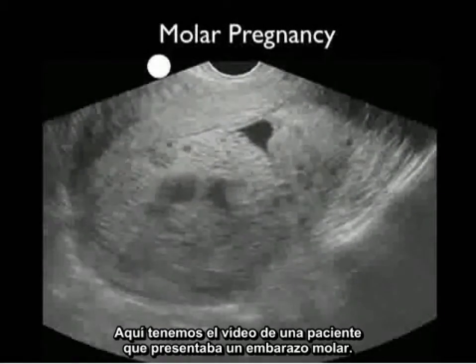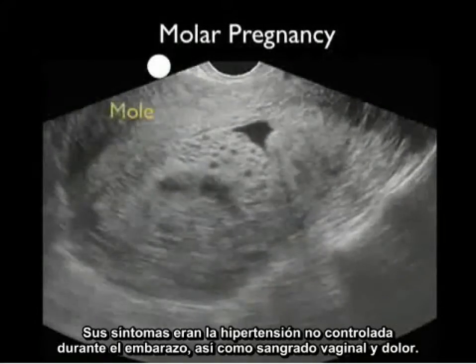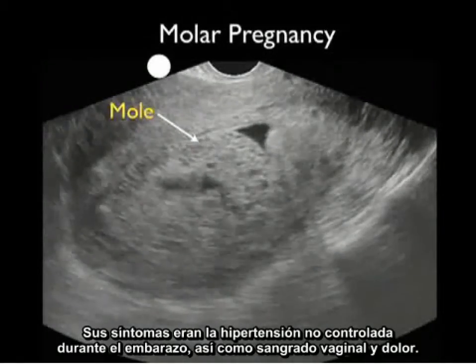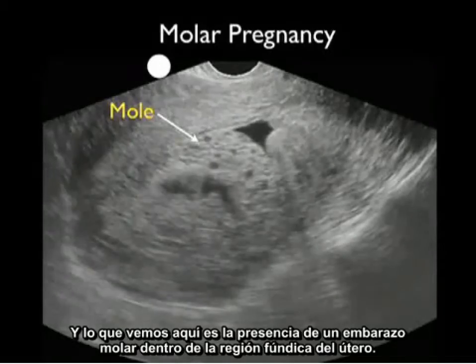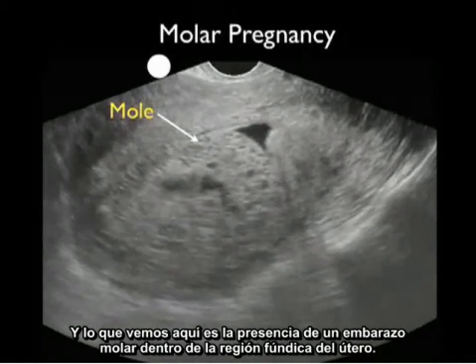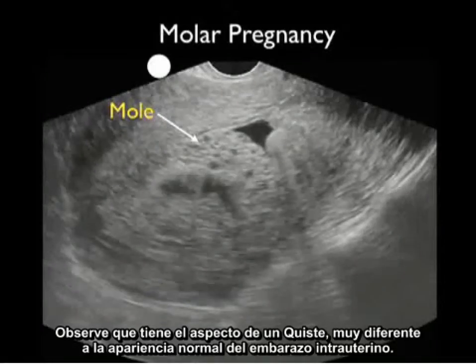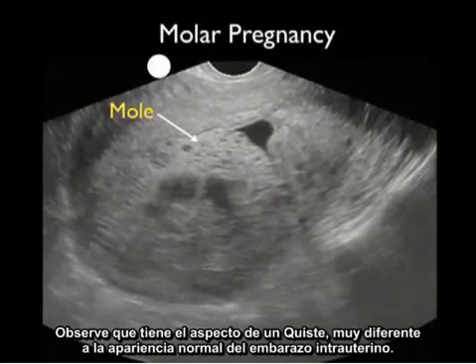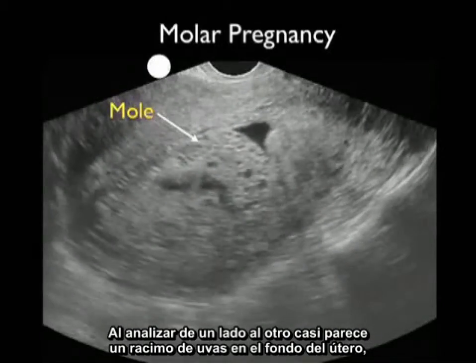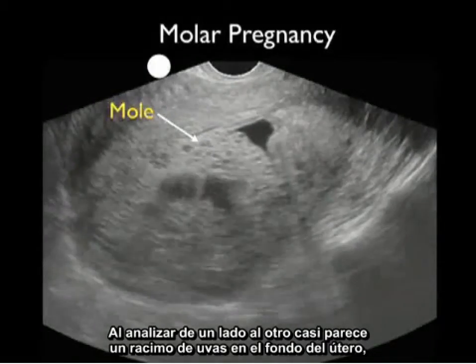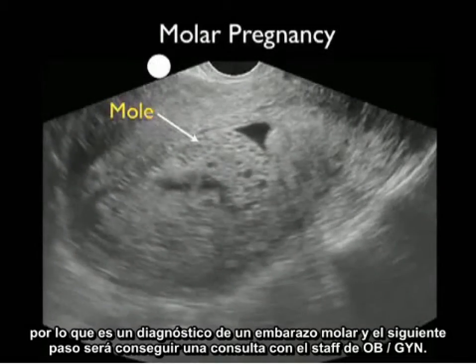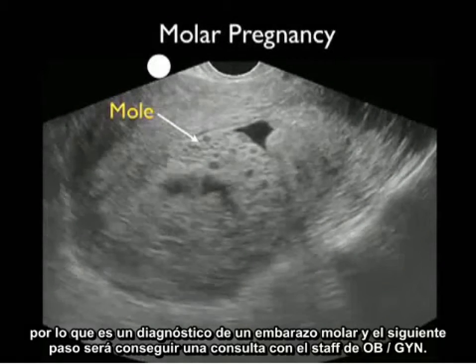Here's video from a patient who presented with a molar pregnancy. Her presenting symptoms were uncontrolled hypertension during the pregnancy, as well as vaginal bleeding and pain. What we see is the presence of a molar pregnancy within the fundal region of the uterus — notice it has a cyst-like appearance, very different from the normal appearance of an intrauterine pregnancy. As we scan back and forth, it almost looks like a bunch of grapes within the fundus of the uterus. My next move was to get an OBGYN consultation stat.